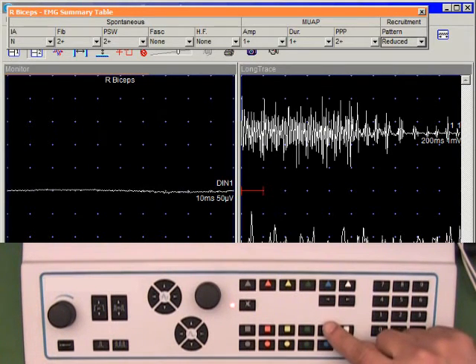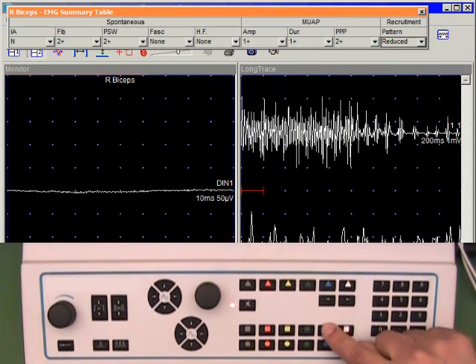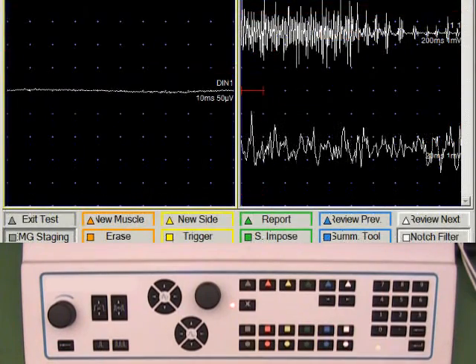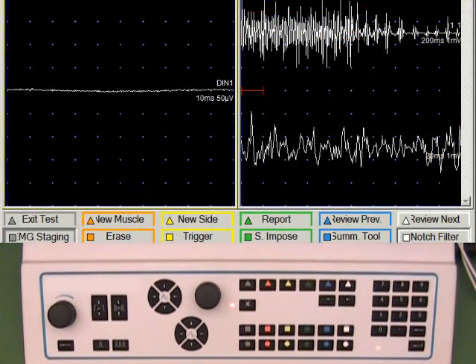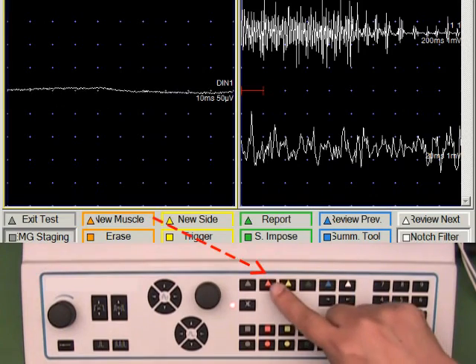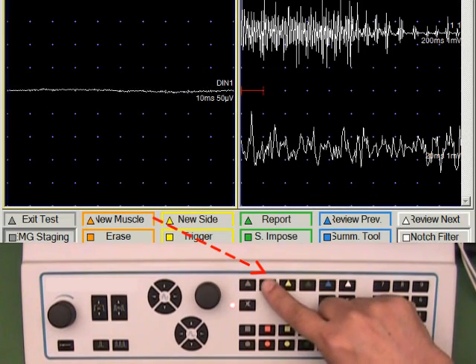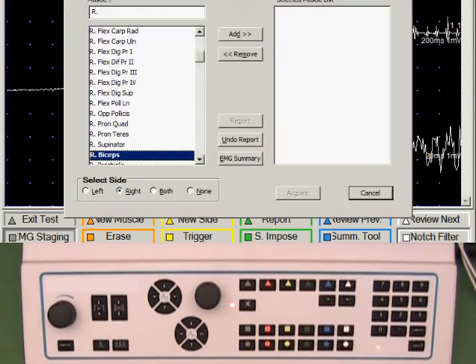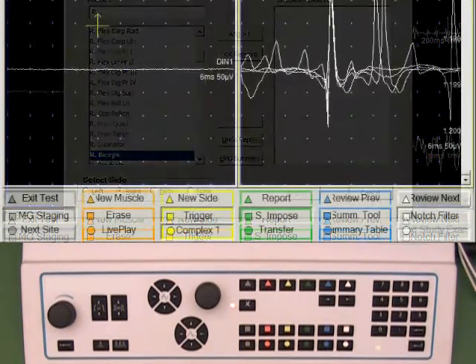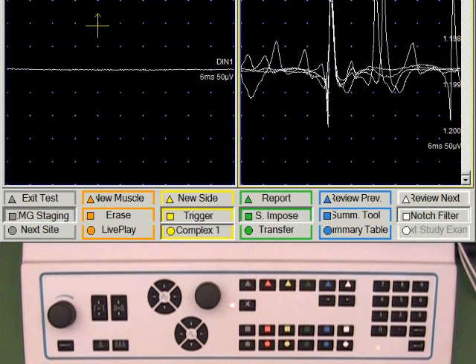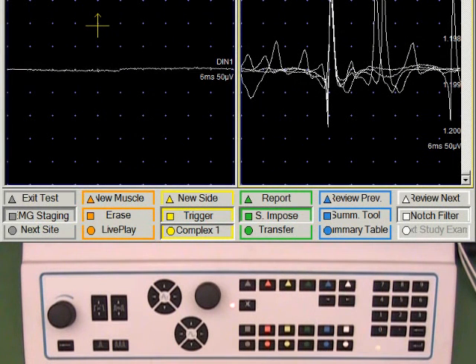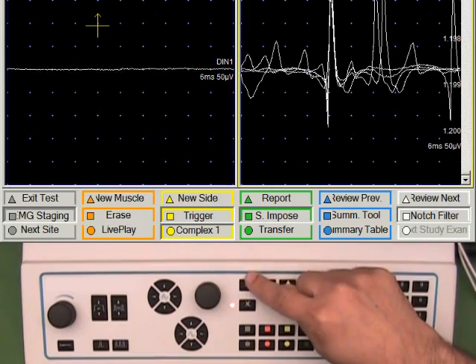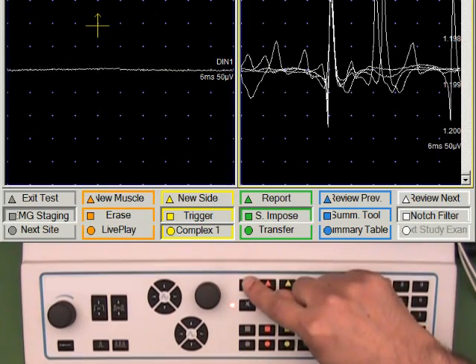I'm going to turn off the summary toolbar. We have completed the examination of one muscle. To study another muscle I will push the new muscle key. Having tested all the desired muscles we can exit the test by using the grey triangle button.